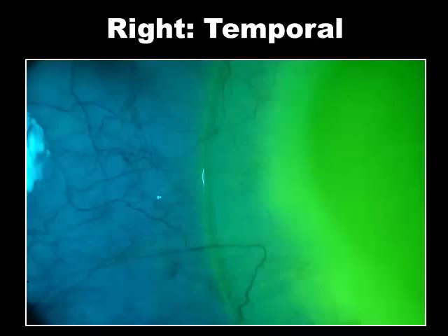Now, if we switch over to the slit lamp, we see a similar story. The lens is vaulting through the cornea, vaulting through the limbus in here, vaulting well onto the conjunctiva before it finally lands itself down and spreads its bearing over as broad a surface area as possible. So not only do we see this beautiful limbal vault, but if we look at all these large and small capillaries in here, they all seem to run right past the lens edge.